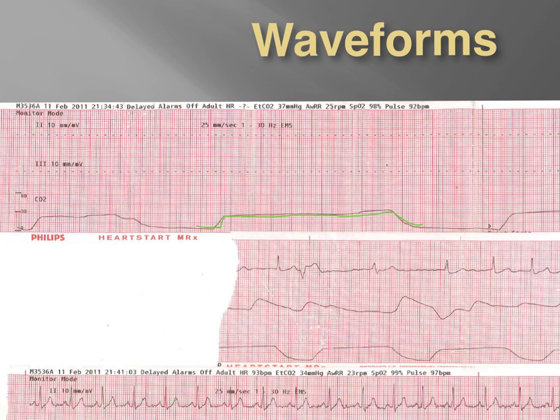People do different things at different times, right? They may hiccup or gasp or have an irregular respiratory pattern every once in a while, which may be noticeable on this waveform. They're not necessarily clean and crisp, but unless they're symptomatic with some type of ailment, I'm not going to get too worked up over it because it just may be an aberrant respiratory pattern. And it may be just something that causes a difference in the fluctuation of carbon dioxide very briefly.